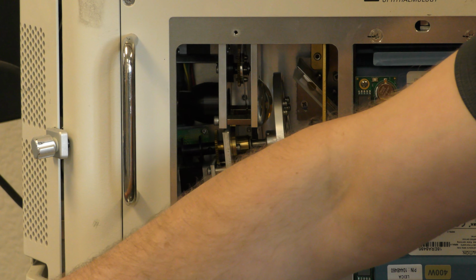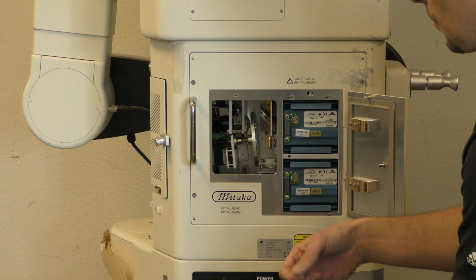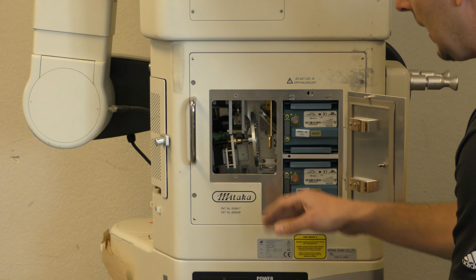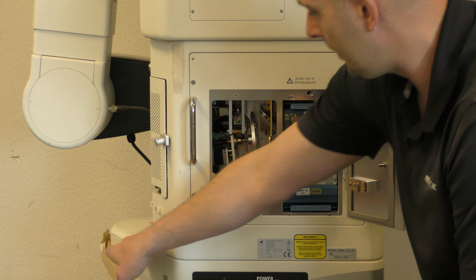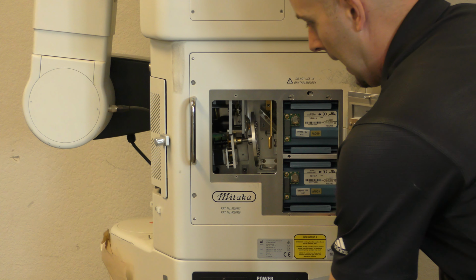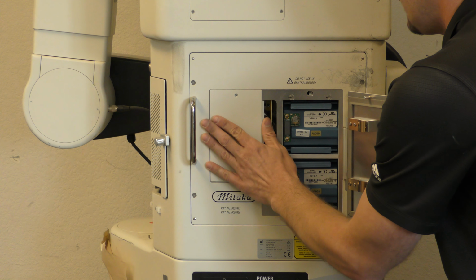There's lots of accumulation of dust here. You can basically guarantee that there's a lot of dust that's accumulated in here as well. So I'll take a Q-tip with a little bit of acetone or alcohol, and I just go clean up these heat filters and the mirrors. And if there's a lot of dust, I definitely get in there. If you had minimal dust, like in the case of this one, I would leave this alone. Just try to use a soft touch. But then I replace this, and the next stage of this is the light source.